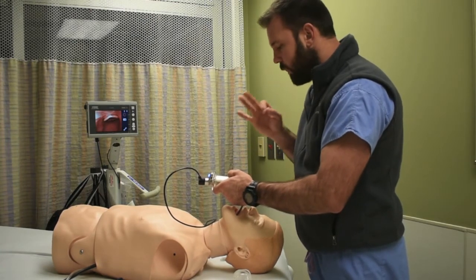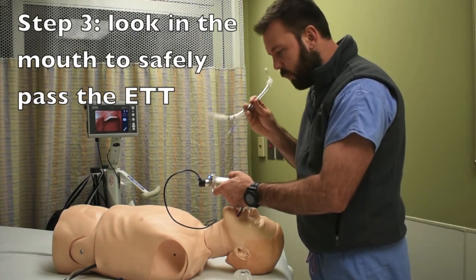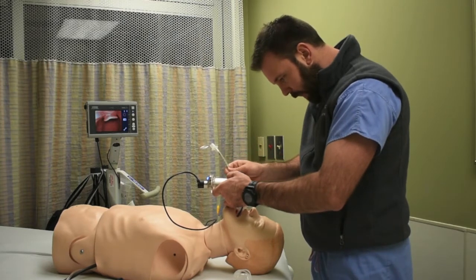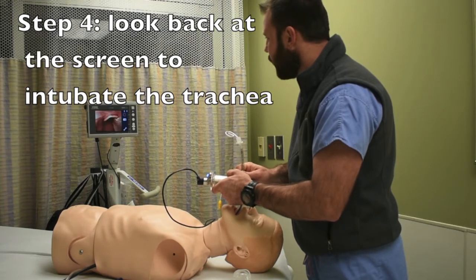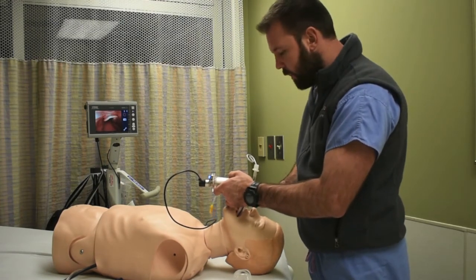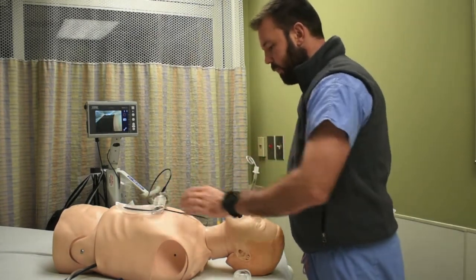Alright, now step 3 goes back just similar to step 1, which is to look in the mouth. We don't want to cause any trauma with our tube. We want to make sure that we're getting back past the tongue, and then we can transition our view back up here to the screen. Alright, we can pass the tube through the glottis, and we've successfully intubated the patient.